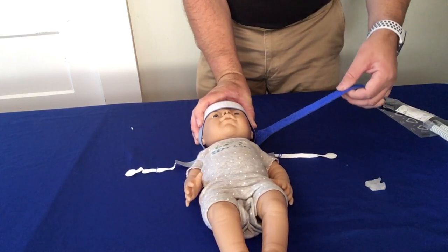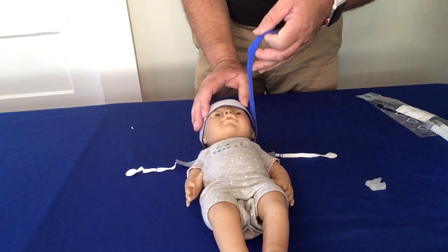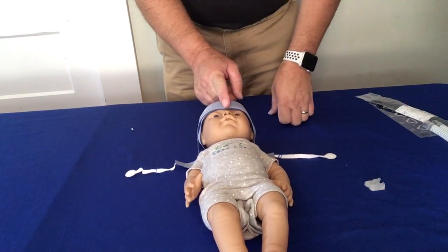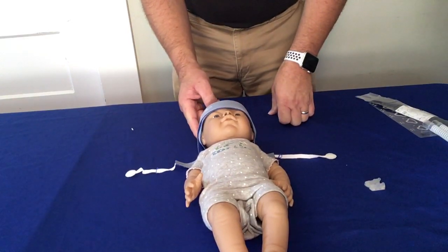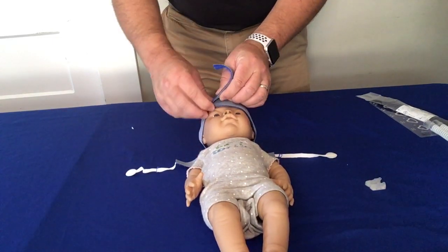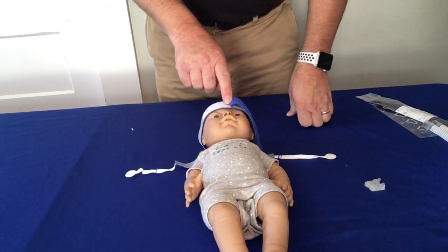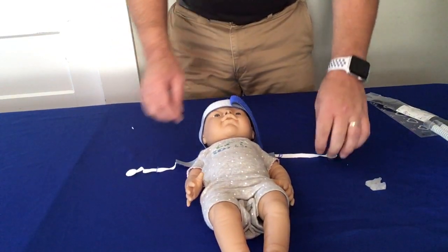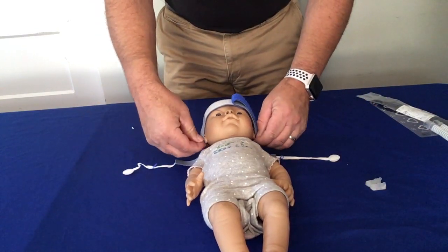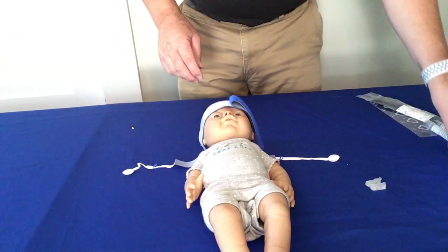And then take the other strap, and instead of stopping, you want to lay the strap all the way over. So don't go halfway, go all the way over on the Velcro and then back it up like so. This will ensure that the strap is secured to the Velcro. Sometimes if you go partial way, you don't get a tight securing of the headgear and it starts to slide off. And then make sure that these straps are somewhat on the ears of the baby.